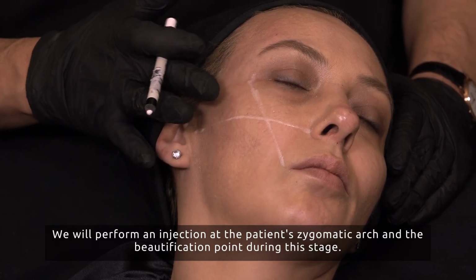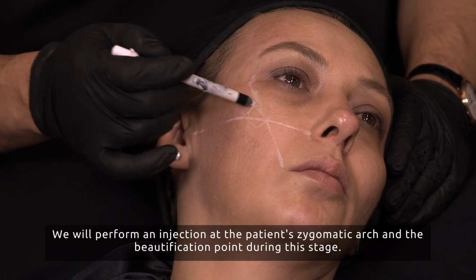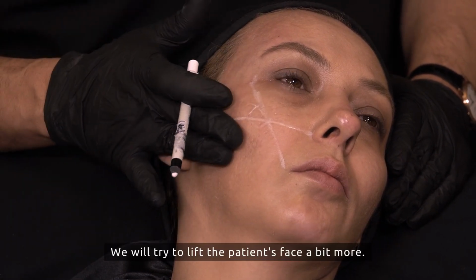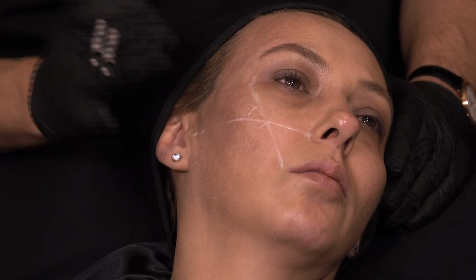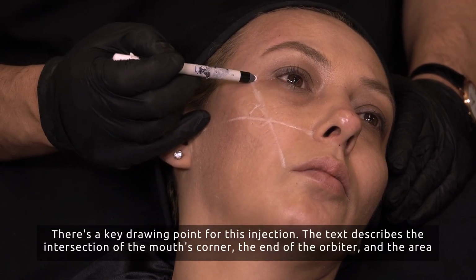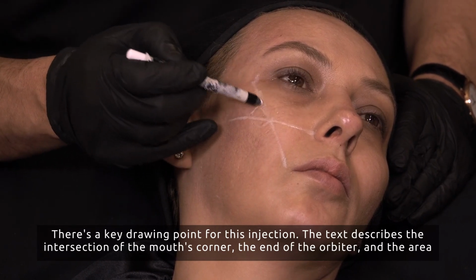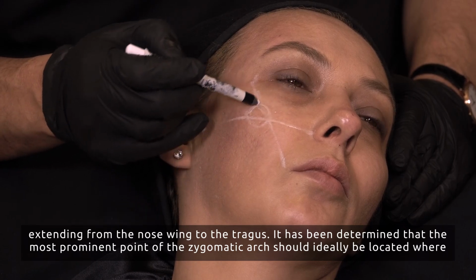We will perform an injection at the patient's zygomatic arch and the beautification point during this stage. We will try to lift the patient's face a bit more. There's a key drawing point for this injection. It is the intersection of the mouth's corner, the end of the orbit, and the area extending from the nose wing to the tragus.